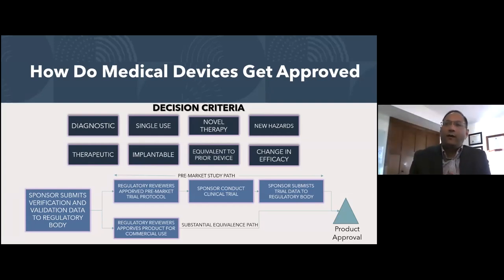No, devices are basically based on the diseases, not on lifestyles. But you do keep in mind the age or the lifestyle when you are implanting a particular lead. Let's say somebody whose disease is in an early state and is going to progress later. You put in a device that can cater to future situations of the disease. Or if this is a young 26-year-old person who needs to be very active for the next 25, 30 years, then you put in a device which suits the person's lifestyle. So you may choose a different location, or a different profile of the device. But that decision comes later. The more important decision is what disease the patient is to be treated for.